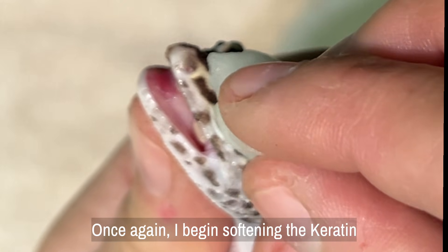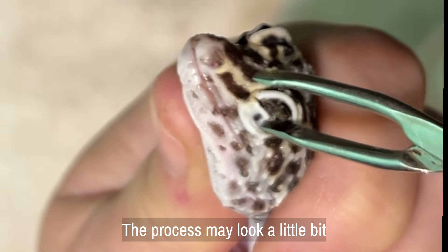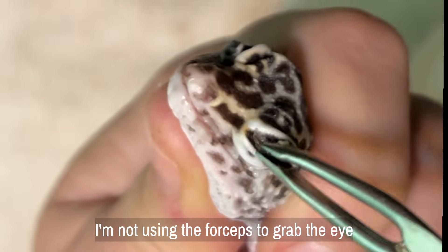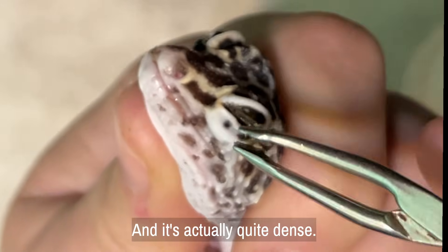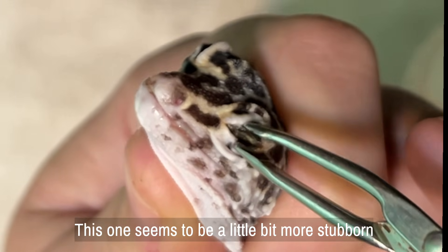Once again I begin softening the keratin plug with warm saline. The process may look a little bit invasive, but it's absolutely necessary to save this gecko's eyesight. I'm not using the forceps to grab the eye itself — I'm only touching the keratin plug. And it's actually quite dense; this one seems to be a little bit more stubborn than the other side.